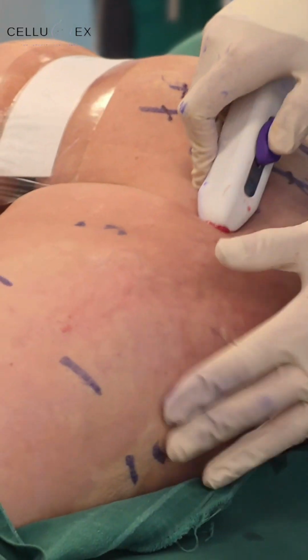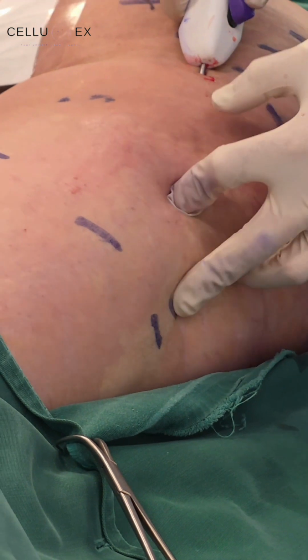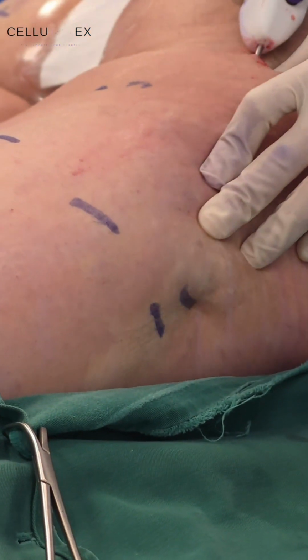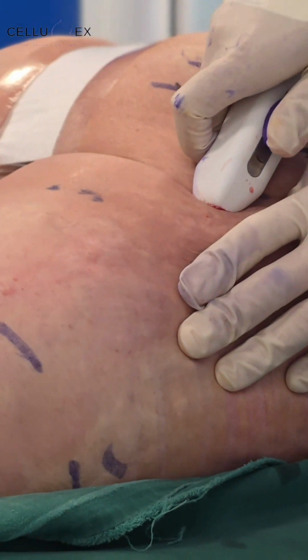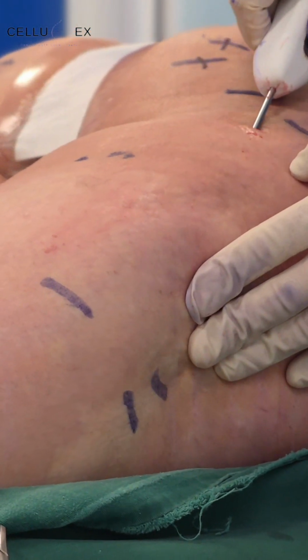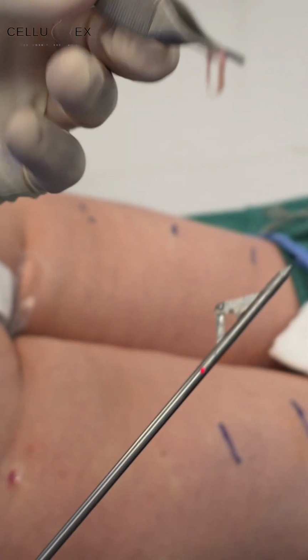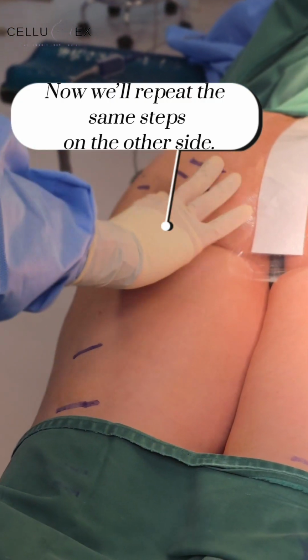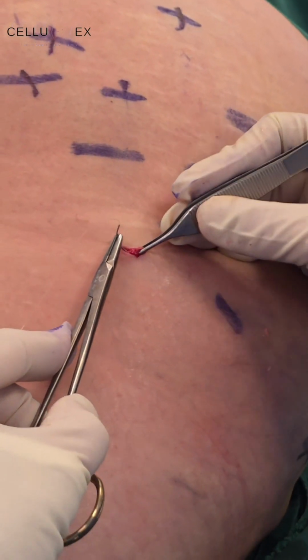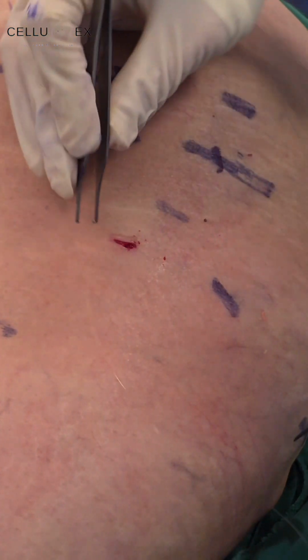So we are reaching the lateral ones, lateral thigh. It's a bit far, but here it is. It is pulling on the fibers. Now we have to release it. Okay, these are the fibrous septum that we have released or taken out from underneath the skin. I use a single subdermal suture to close the skin. I don't have to remove it later on.